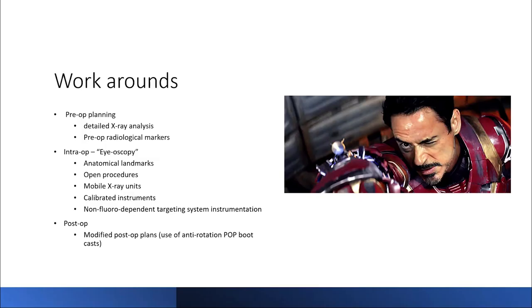So if you were doing a SCFE, for example, or if you are attempting to do a guided growth for an open physis, you place your K wires, have the mobile X-ray brought in, you take your X-rays intraop and wait for the films to be developed. And then you see which of the wires is where you want it to be. The problem with that is it causes an unnecessary prolongation of surgery.